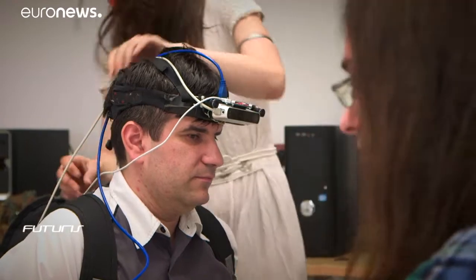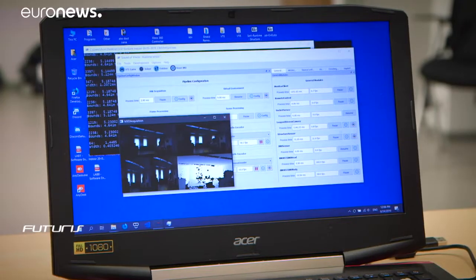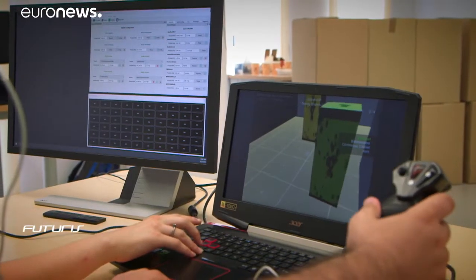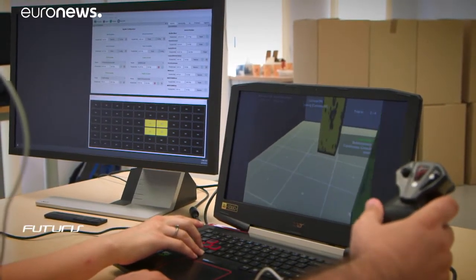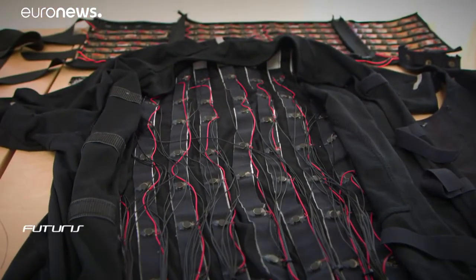The system includes some 3D cameras that continuously scan the environment very fast, 20 times each second. Then we process this information with some computer vision algorithms and we break it into individual objects. And each individual object is presented to the user through some 3D computer-generated sound, so he basically hears the objects, and through vibrations on a belt on his abdomen.